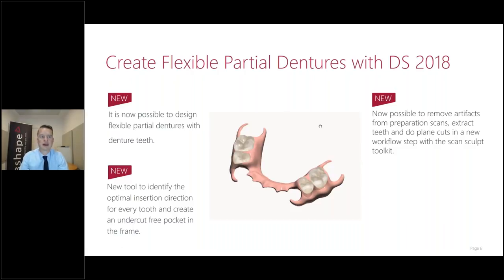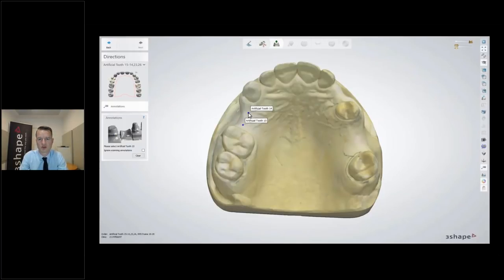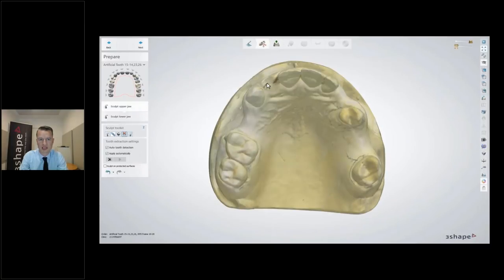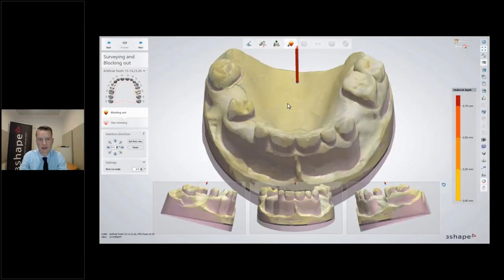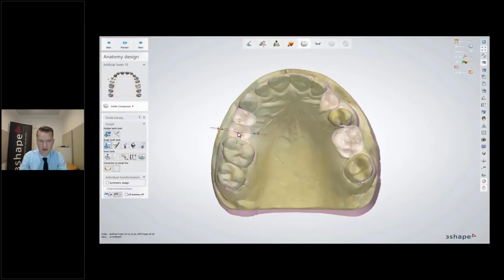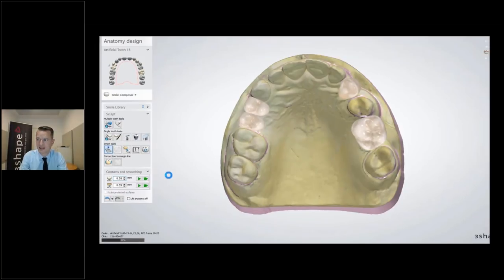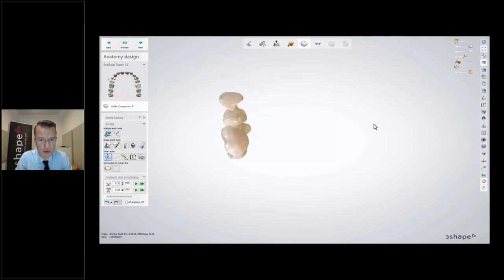We have users doing a lot of flexibles every day with these new design tools. In the flexible design workflow you can push teeth, artificially remove teeth, do the block-out step, and do wax trimming for clasps and retention. The next step is to design the denture teeth — partial denture teeth — with the ability to cut to gingiva or to neighboring teeth.